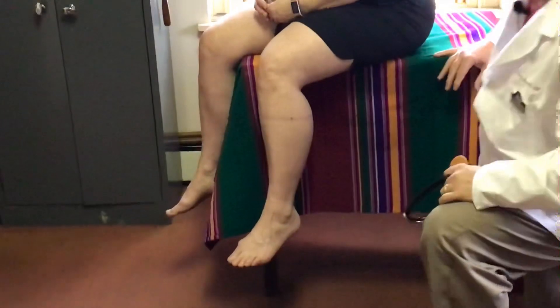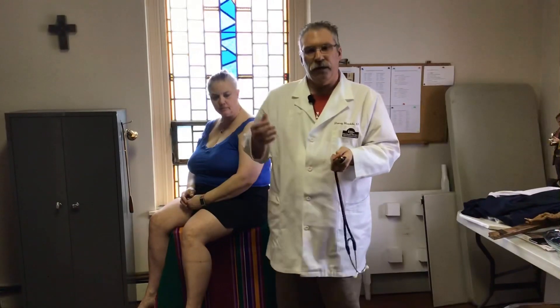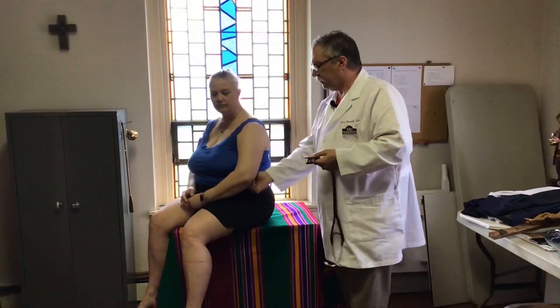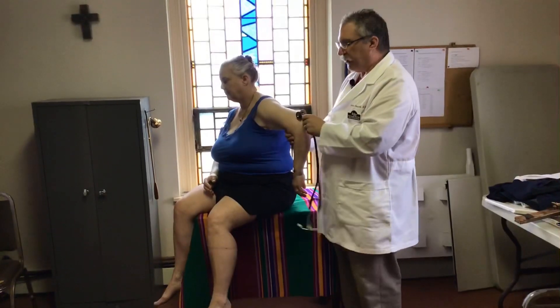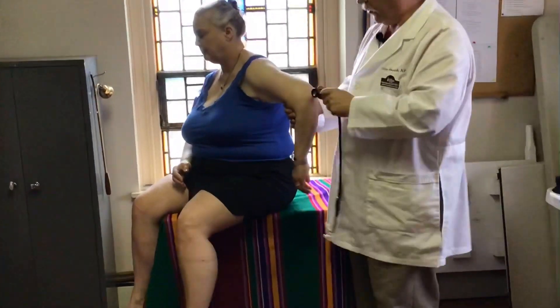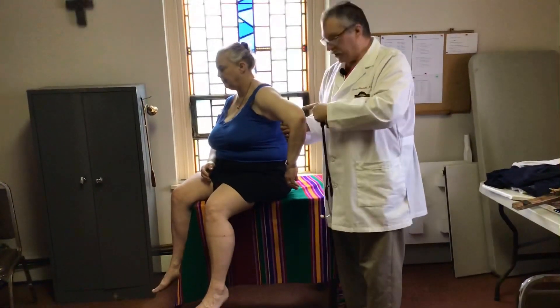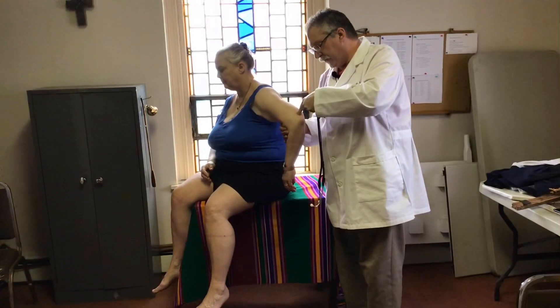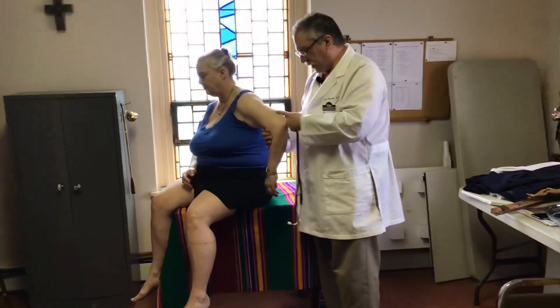And that's all there is to it using your stethoscope as a reflex hammer. It doesn't matter if you go this way or this way. One tip for the tricep tendon: you don't want to go crossways. You'll get a better response if you go vertical to the arm, because you're going to strike right in that groove. If you go the other way, you'll strike across the groove — so you'll get a better response going vertical.